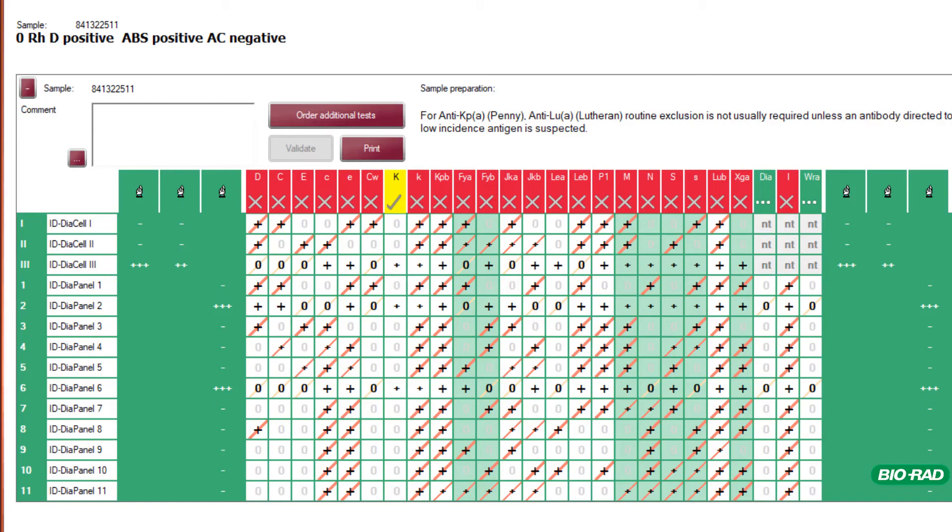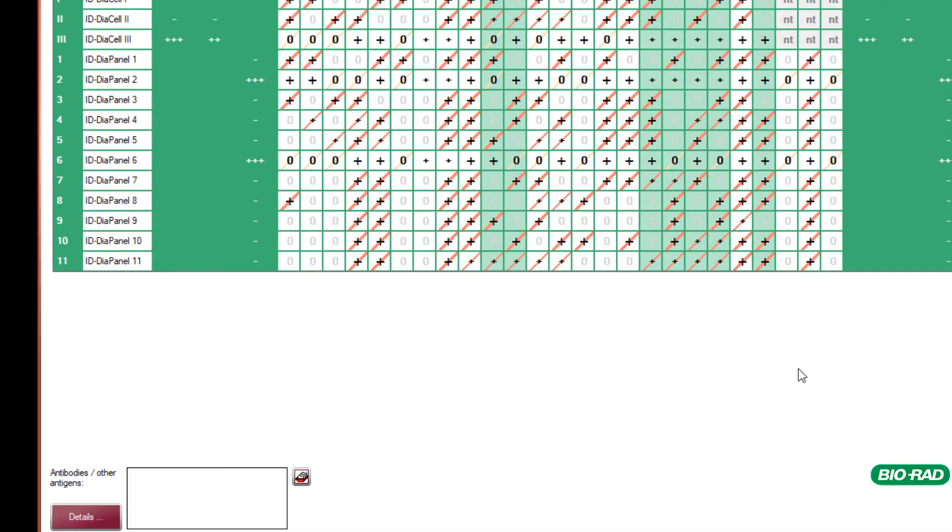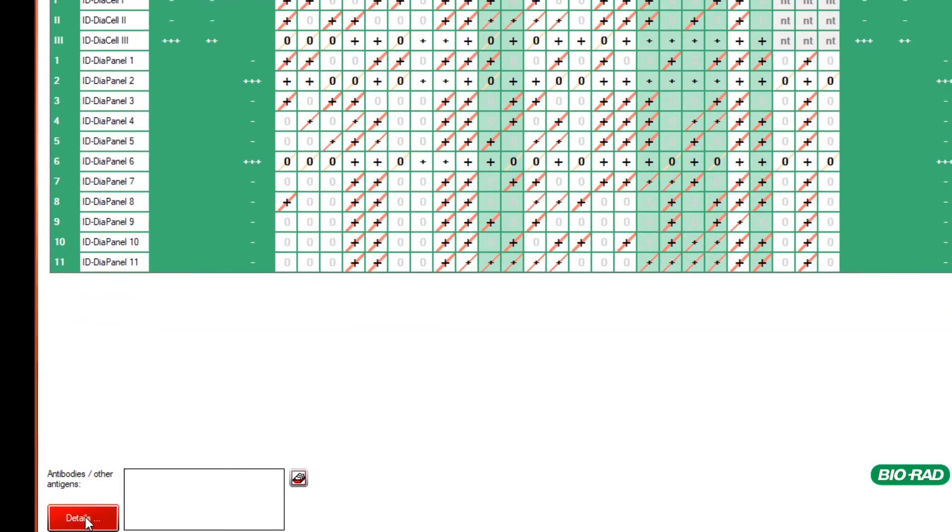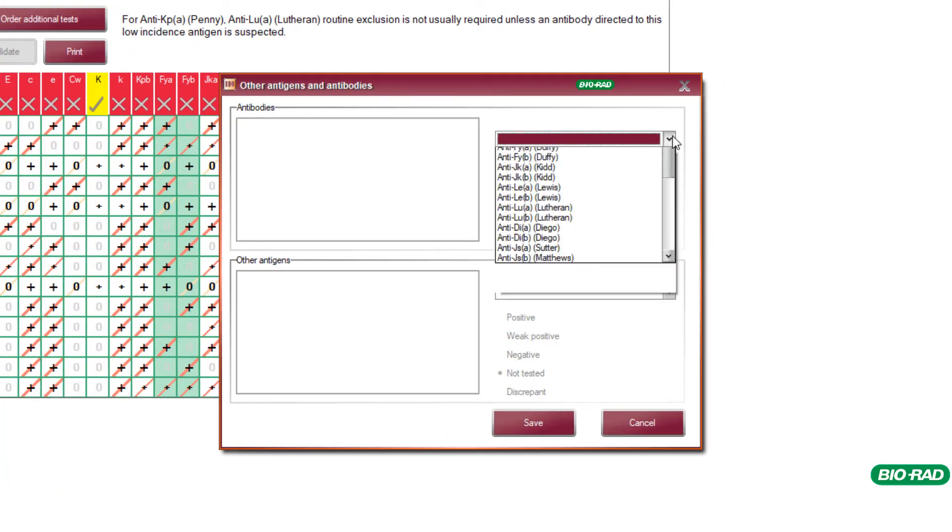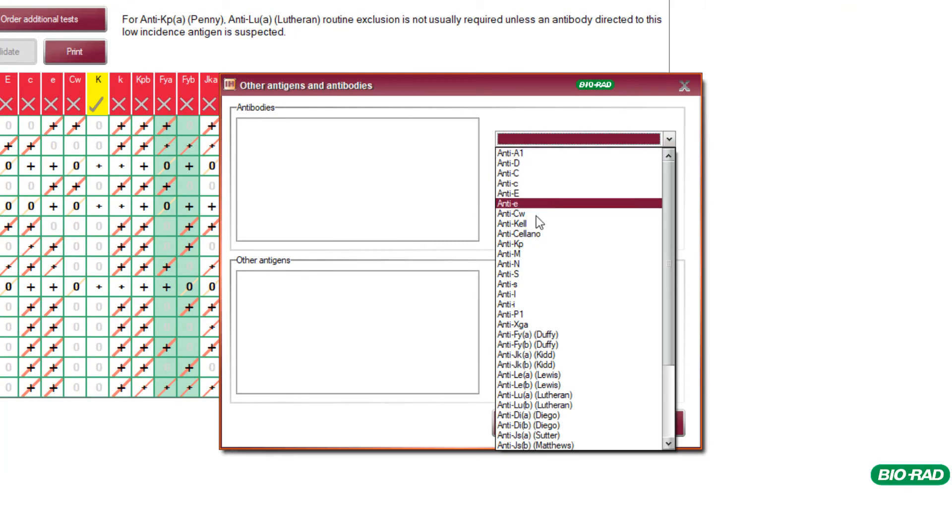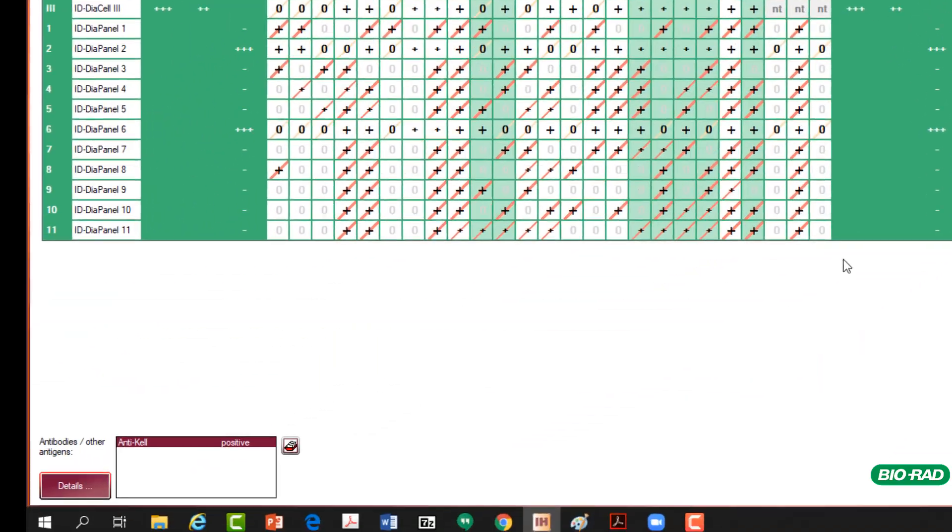The transfusion scientist must make the final assessment of the antibodies present in the patient sample. This can be recorded from a drop down menu. Define the reactivity and this is then saved against the patient file for future reference.